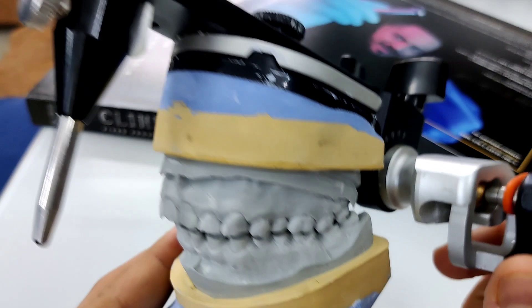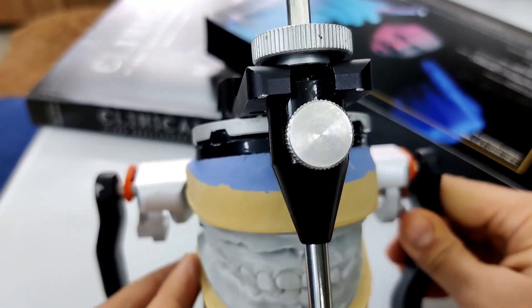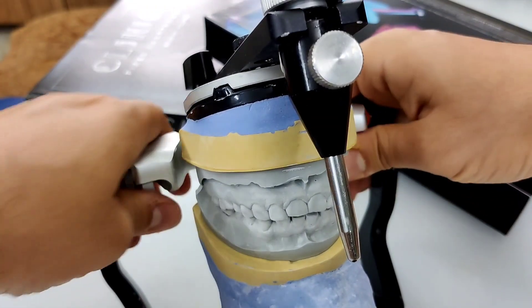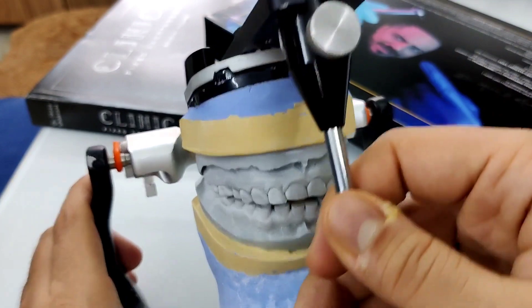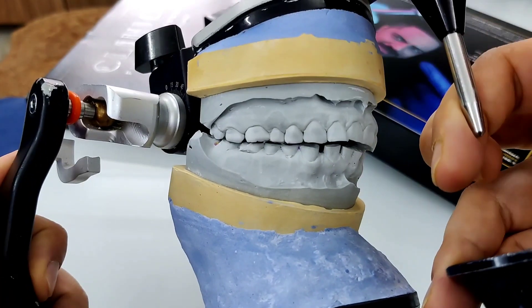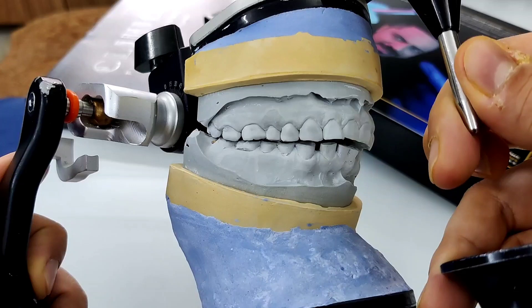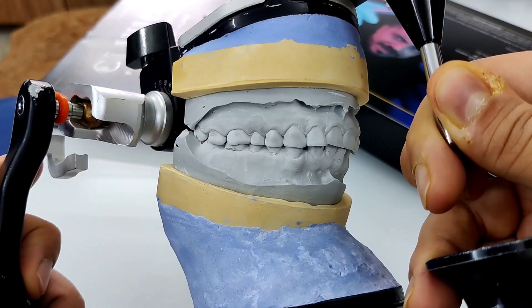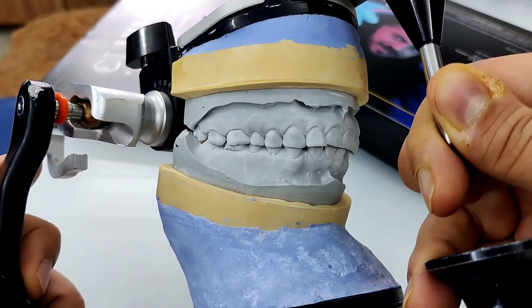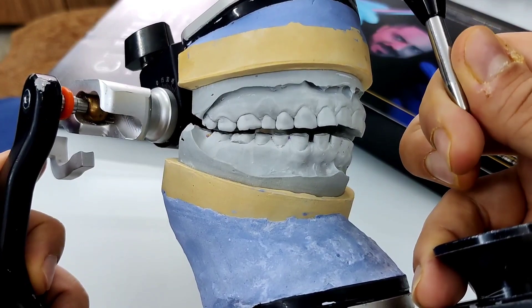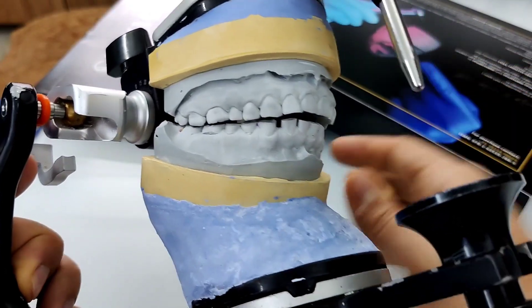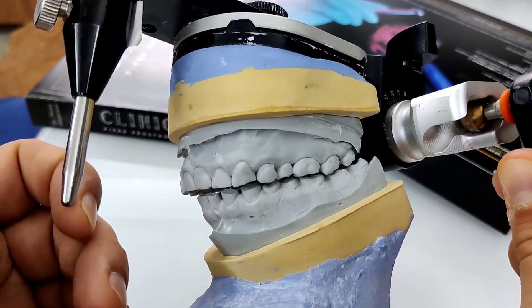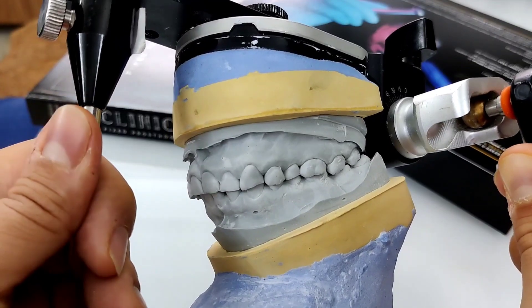What's important to recognize is that this patient needs a full mouth rehabilitation because there is a hit and slide occlusion. If I open these centric latches, you can see this is the patient's contact in CR, but as the patient clenches down, the mandible slides and comes into MIP. There is beautiful intercuspation in MIP on the right side, but as I take this case into centric relation, the entire intercuspation changes. A similar situation on this side — here you have the hit and then the slide into MIP.